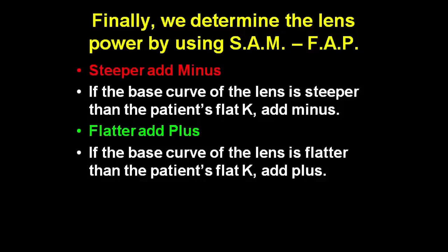Now, my intention is to do a series of these webinars where we're talking about bi-toric design, keratoconus designs, reverse geometry designs, and multifocal designs. So I really appreciate Josh and Janice's support with this at Valley Contax, and hopefully you'll follow along as we walk through step by step how to design some of these more complex fits.